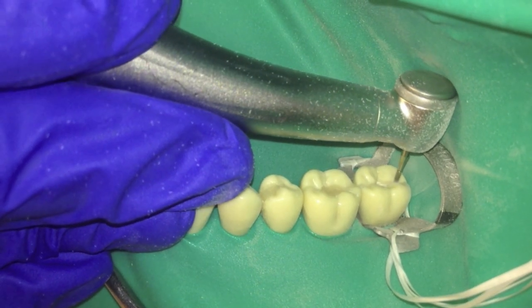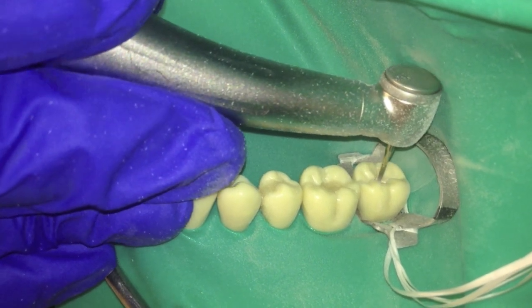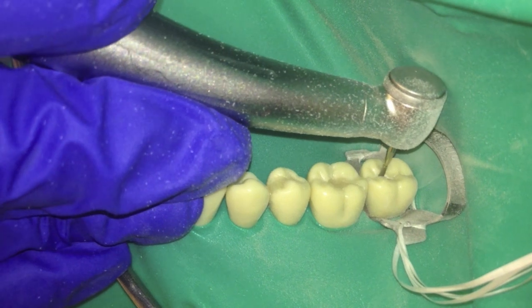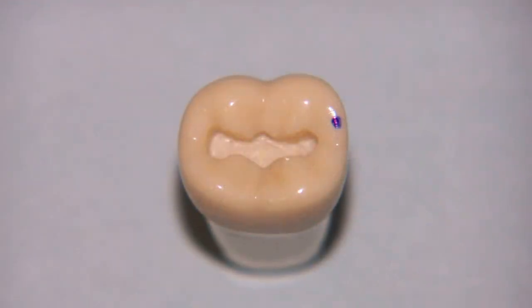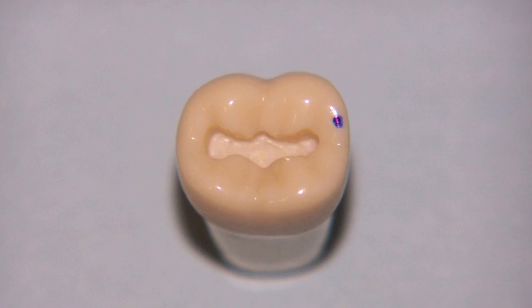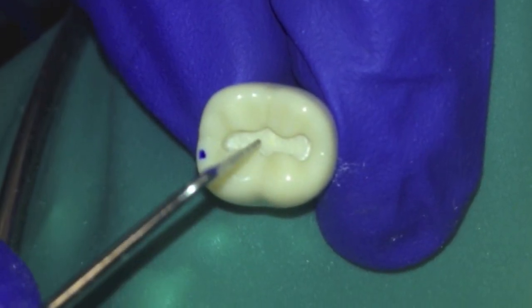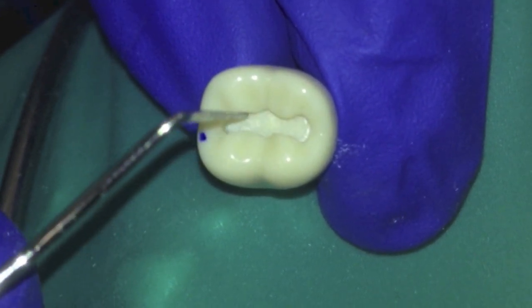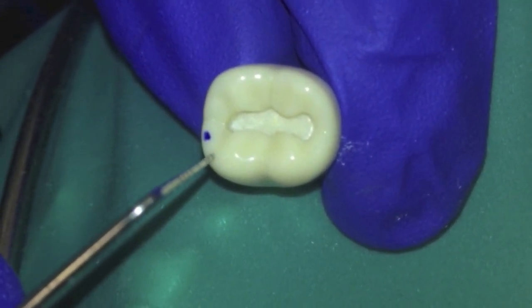Continue to prepare the Class I portion, maintaining a flat pulpal floor. Marked in blue is the contact area for tooth number 18. The Class I portion is centered; however, the box will be centered around the existing proximal contact.